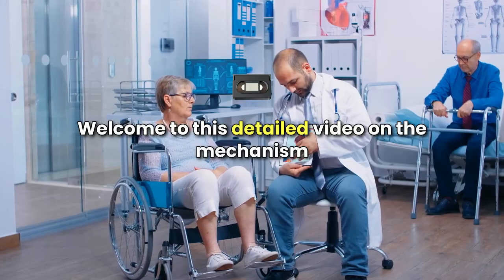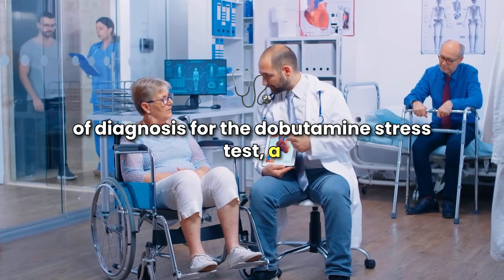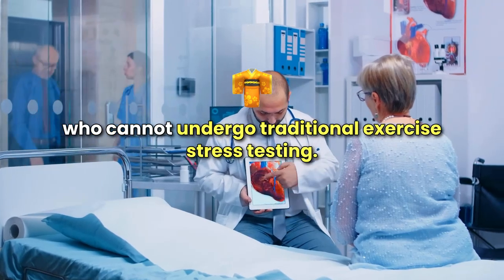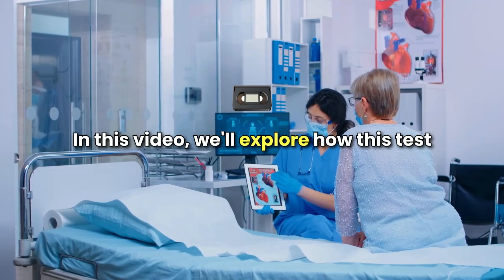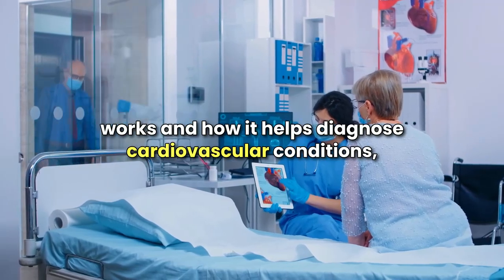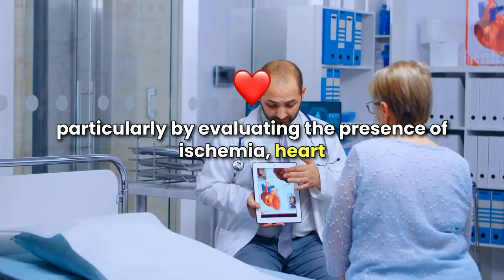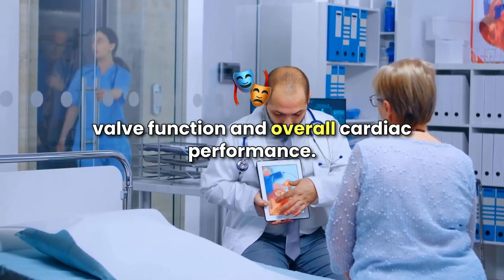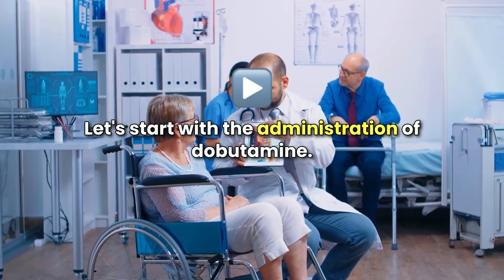Welcome to this detailed video on the mechanism of diagnosis for the dobutamine stress test, a critical tool for assessing heart function in patients who cannot undergo traditional exercise stress testing. In this video, we'll explore how this test works and how it helps diagnose cardiovascular conditions, particularly by evaluating the presence of ischemia, heart valve function, and overall cardiac performance.